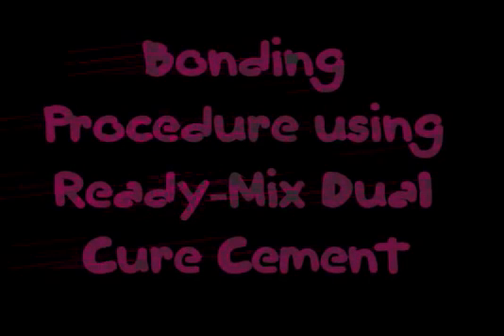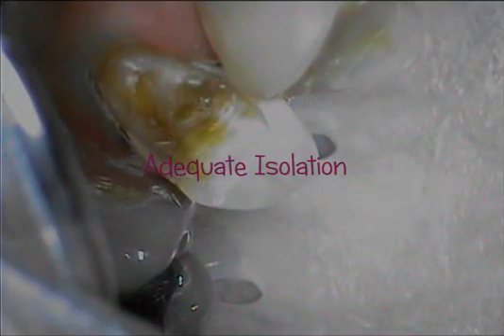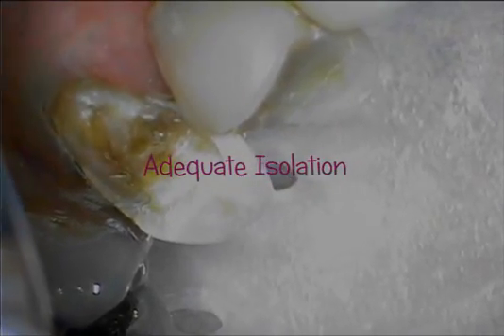Hello. Resoment ReadyMix Dual Cure Cement is an excellent luting agent, especially for CEREC-type restorations or milled restorations.